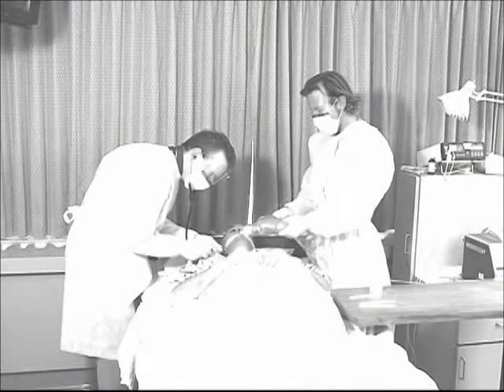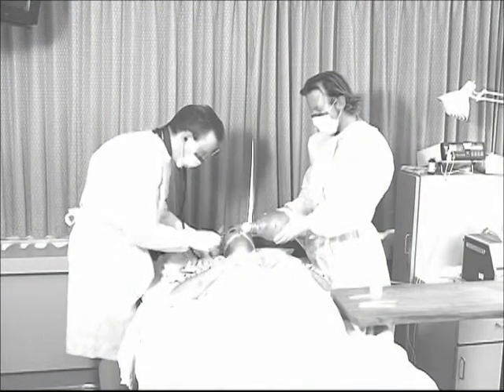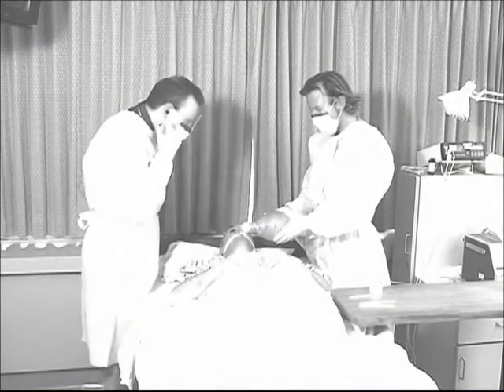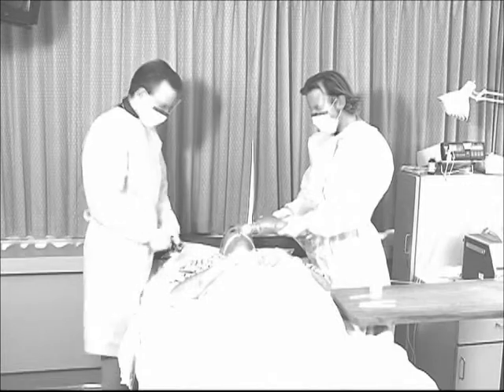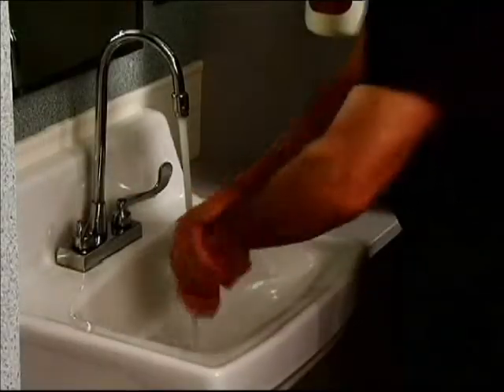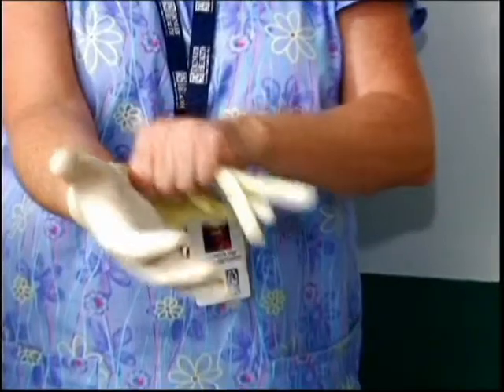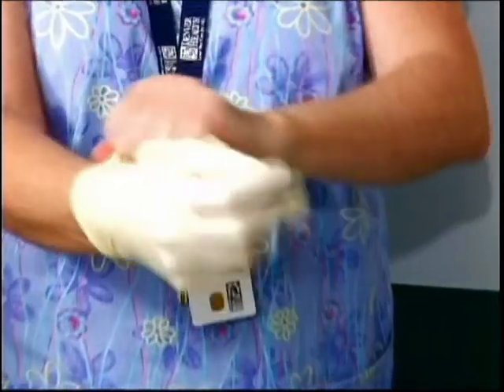Secretion clearance is discussed in the airway suctioning training module. The other two airway maintenance techniques will be discussed in this module. As always, wash your hands and follow standard precautions. In general, always wear gloves while providing airway care.